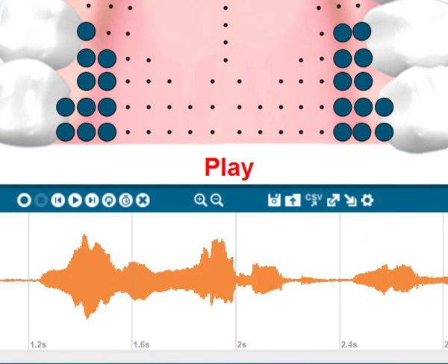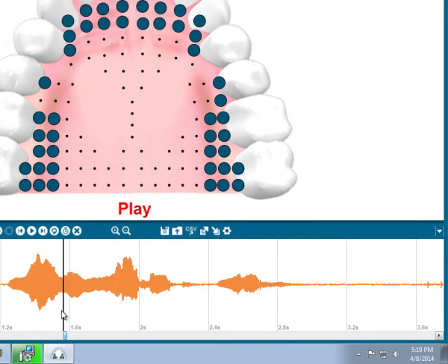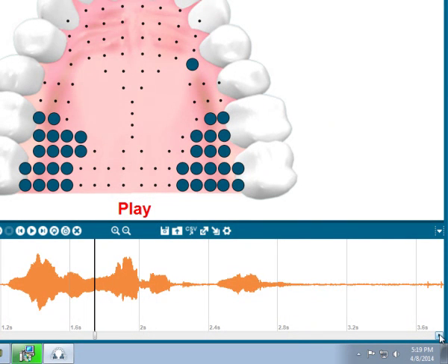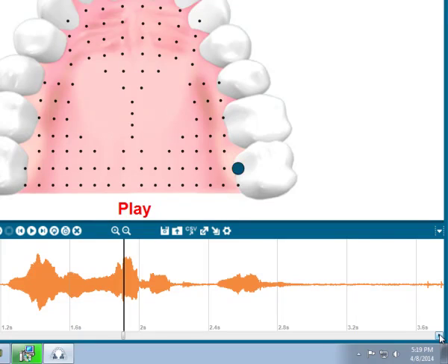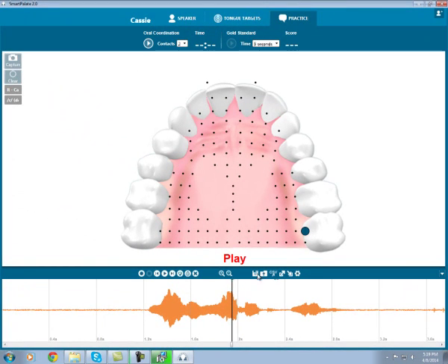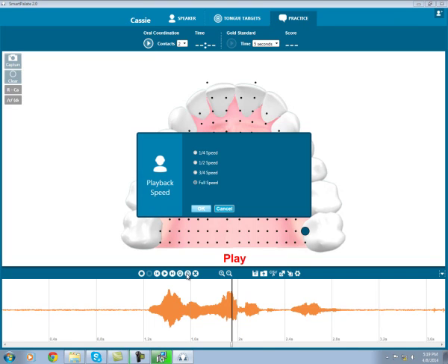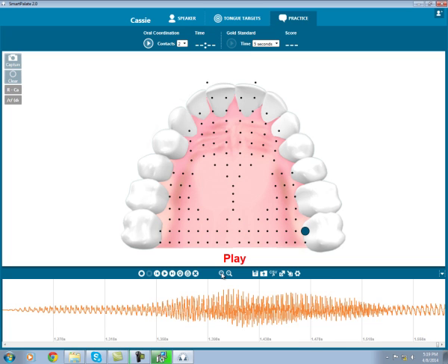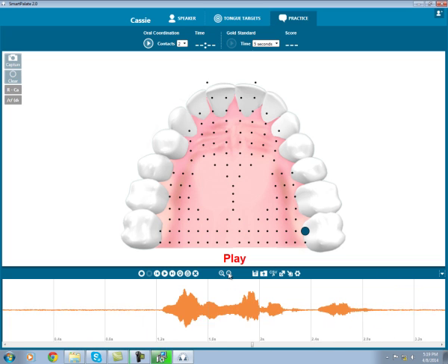Stop or pause. Scroll through the recording. Or click through frame by frame. If you find it helpful, you may loop the playback, or even play it back at 3 quarters, half, or 1 quarter speed. If I wanted to zoom into a particular part of the recording, I would use my mouse to highlight it and press the zoom in button. You can then zoom back out to view the entire recording once again.